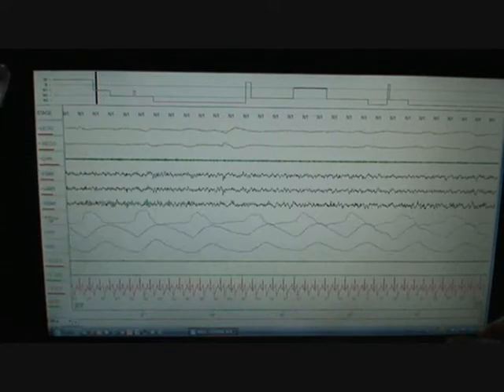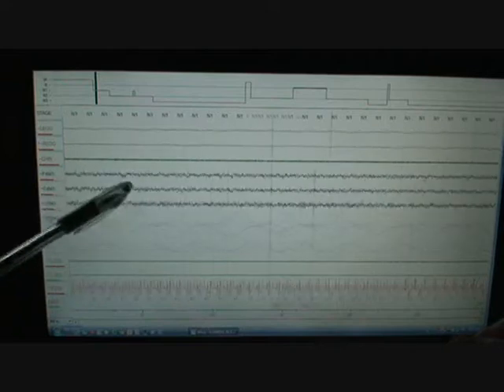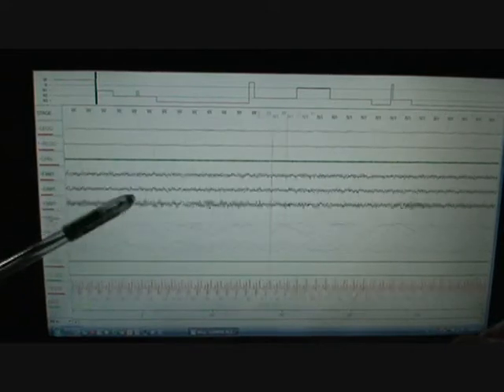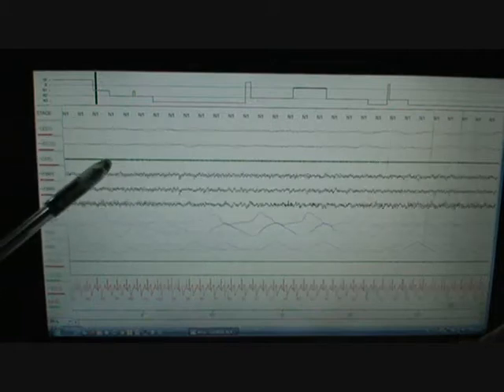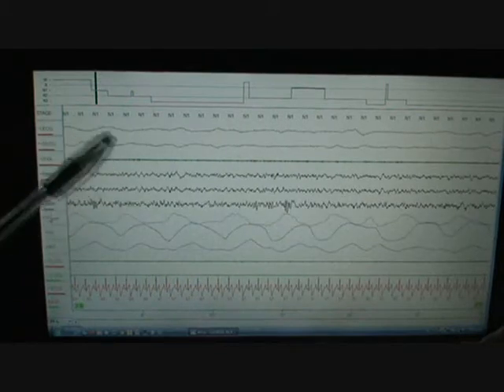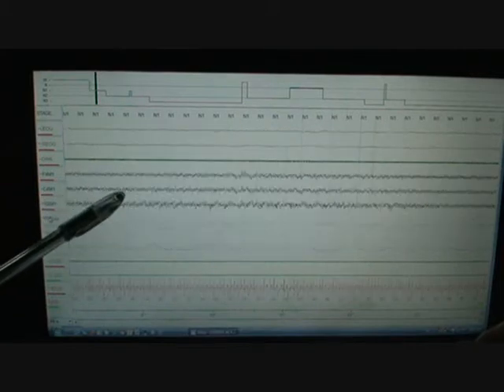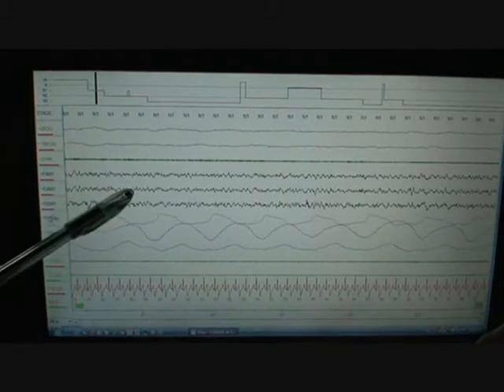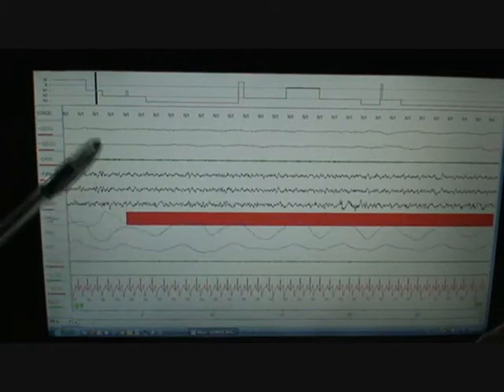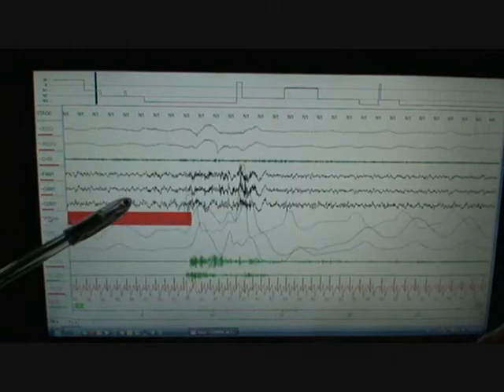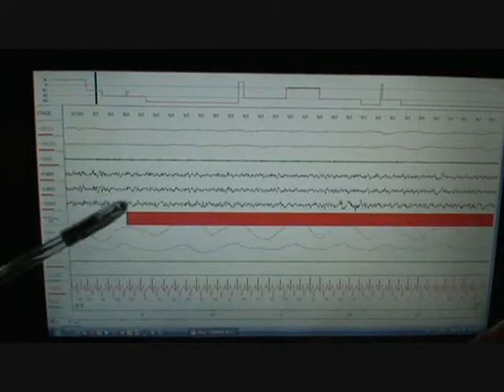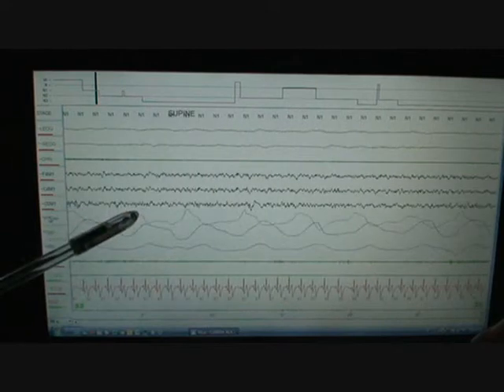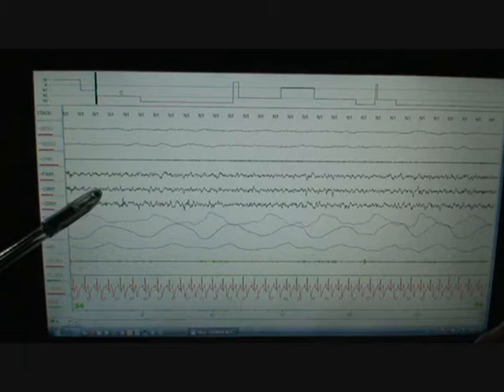So something distinctive about stage one sleep is that you'll see something called vertex sharp waves. I actually don't see these all that often. I don't see any here as you see the mix voltage, low frequency rolling eyes. So what we're next going to be looking for is another stage change. So we just keep going in 30 second epochs, and we'd be saying one, one, one, until we find something. They awake and then add it back to one, one, two.